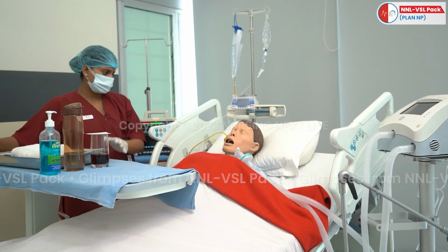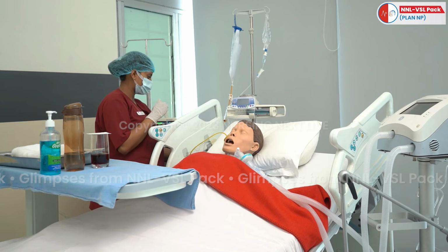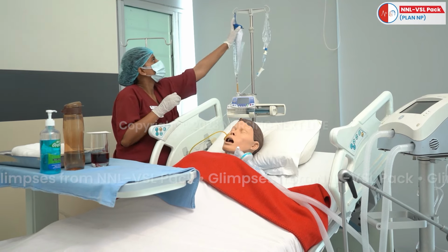Pour an appropriate amount of water in the bag to post-flush both the empty tube as well as the gravity bag tube.